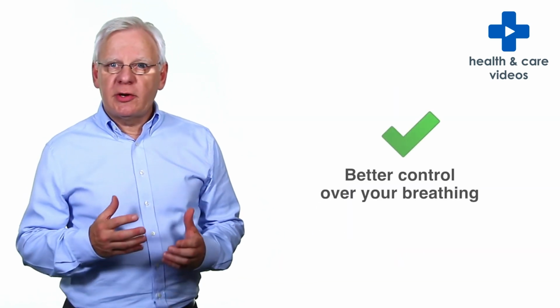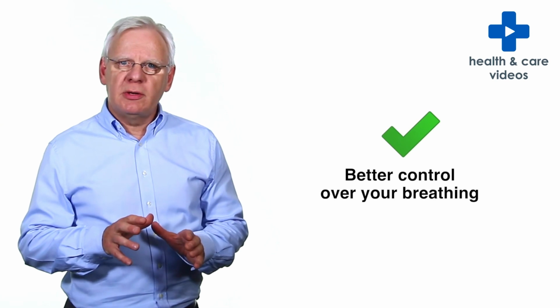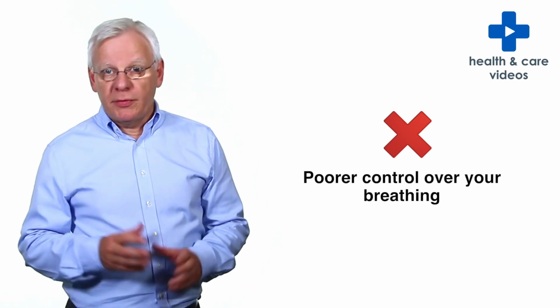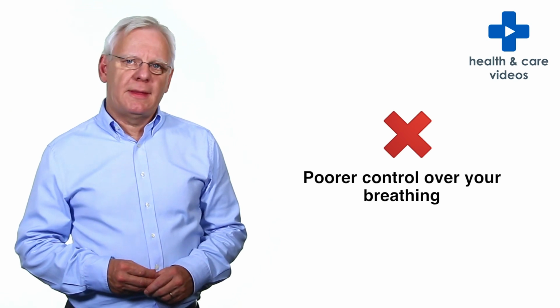If you use your inhaler correctly, you will get more of the medication into your lungs, giving you better control of your breathing problem. But if used incorrectly, you may have poor control of your condition, with the risk of side effects such as a sore throat or mouth infection.